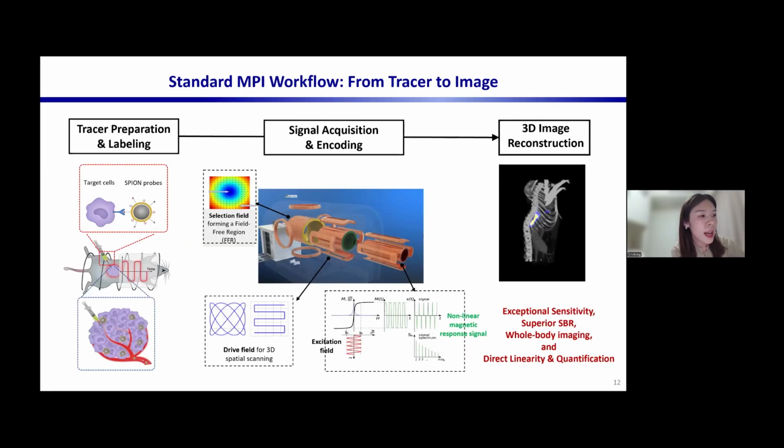In this slide, we show a standard workflow of MPI. This workflow, I would say, is a truly multidisciplinary process involving chemistry, biology, physics, and mathematics. It starts with chemistry and biology because MPI is a tracer-based modality, so the SPIONs are very important.